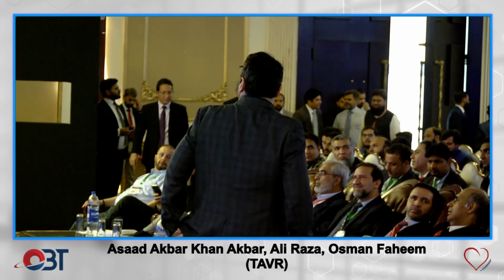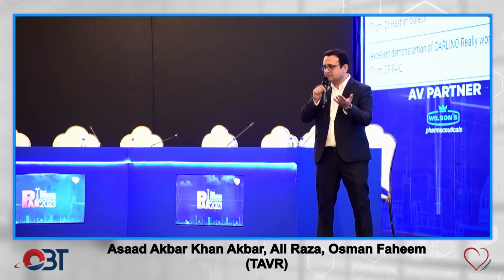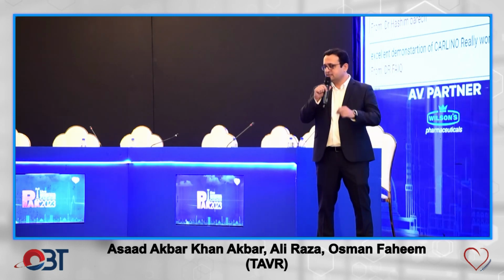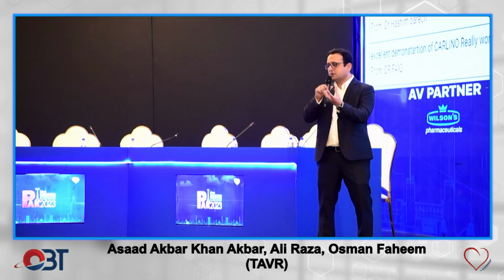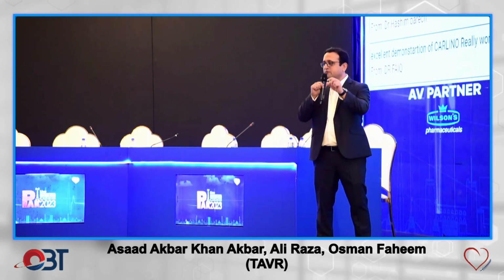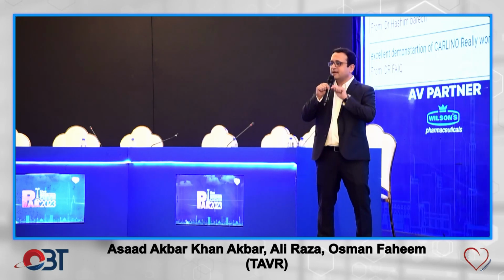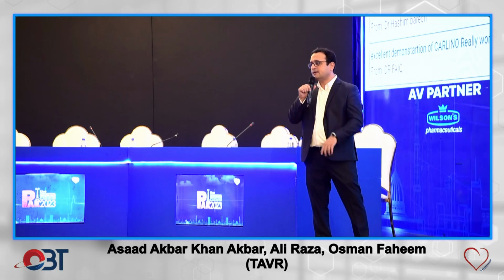Just one thing about the audience, like Professor Bilal Saab's question was so relevant. Paravalvular leak is one of the things that has shown a significant mortality disadvantage for these, and the reason is that these ventricles are very hypertrophied. There's not much space in them, and if you induce AR in them, they have been tolerating AS for a very long time. Now if you induce volume overload in them, it's a pressure overload system, and you have added another problem with it. So they won't live too long with that.